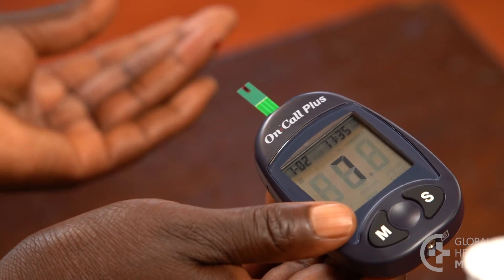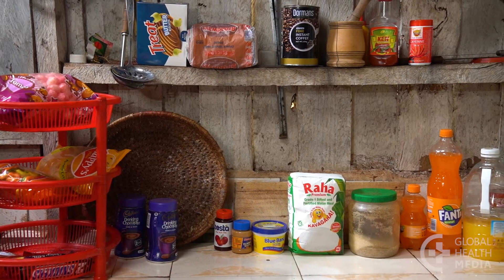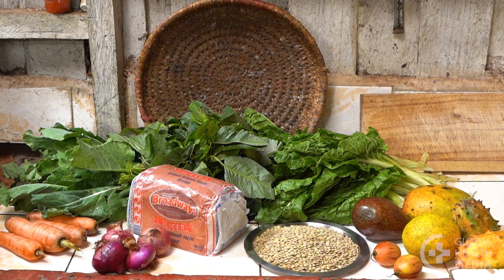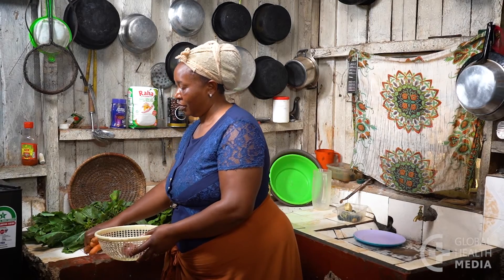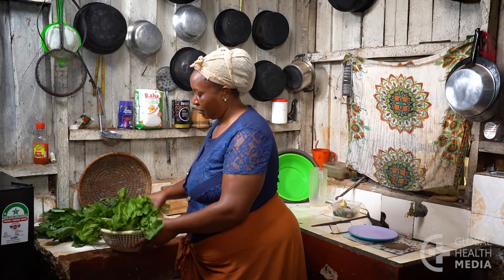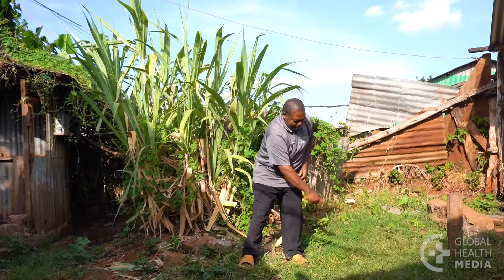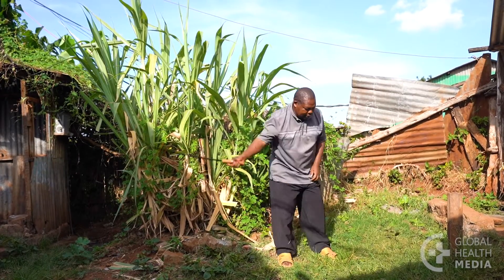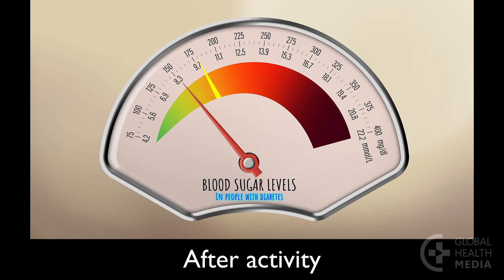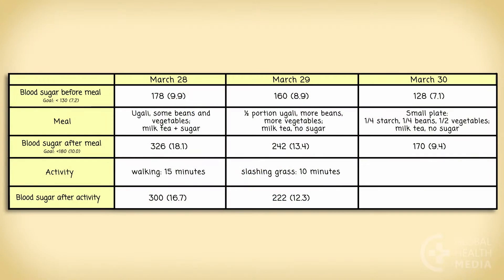Measure often in the beginning. Learn which foods cause your blood sugar level to rise too much and which foods give you healthy blood sugar levels. When your blood sugar levels start coming down after meals, you will feel better and have less hunger and fatigue. Being active soon after eating will help lower your blood sugar. Check your blood sugar after the activity. After slashing grass for 20 minutes, the blood sugar dropped 40 points, demonstrating how powerful activity is in lowering blood sugar, especially after a meal. Be sure to include activity and blood sugar levels on your record.